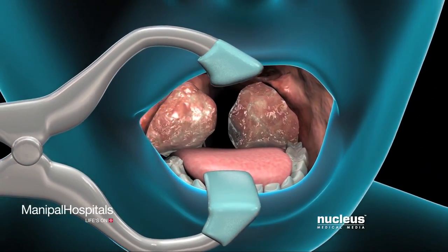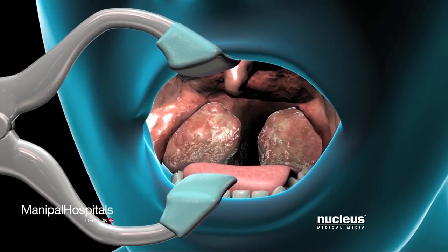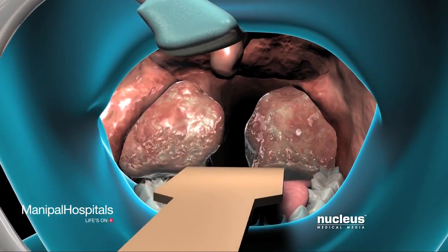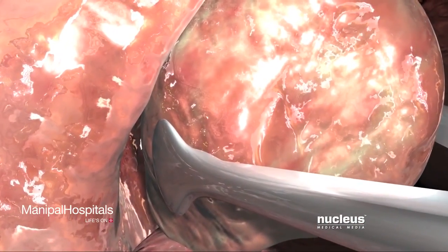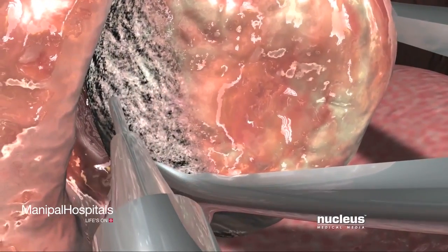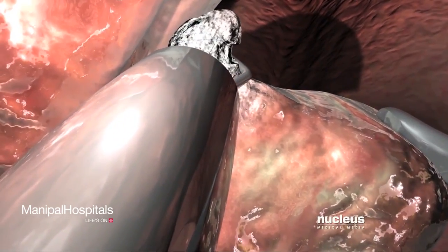During your tonsillectomy, your surgeon will use a special retractor to hold your mouth open and a tongue depressor to ensure an unobstructed view of your tonsils. Your surgeon will grasp each tonsil one at a time with tonsil forceps, cut it away from the surrounding tissue, and remove it with a snare or a tonsil guillotine clamp.